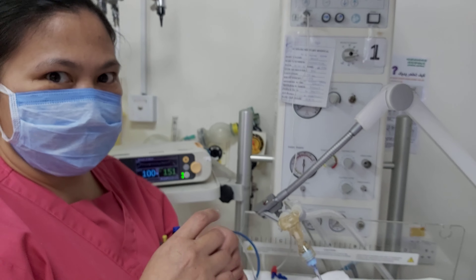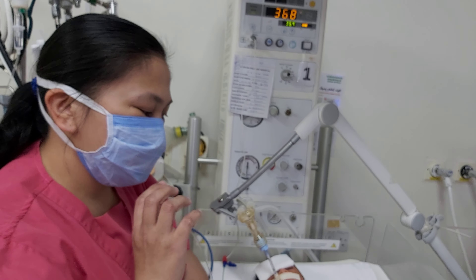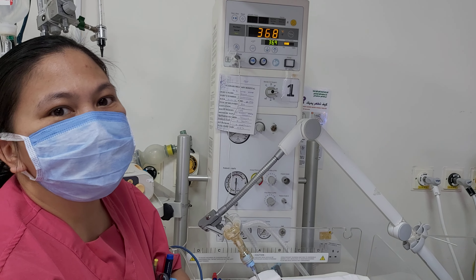The third one is to check the length of the ET tube through chest X-ray.